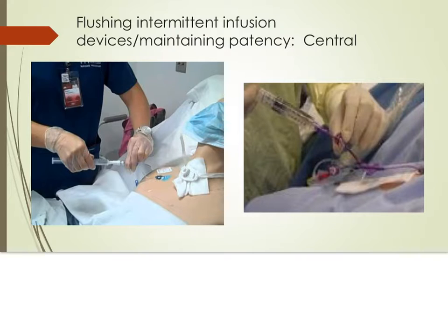Use a turbulent flushing pulse technique or start-stop technique. As you flush, carefully monitor the IV site to make sure there is no leaking, swelling, redness, sudden increase in heart rate, or patient complaints of sudden shortness of breath or chest pain. When the flush is complete, continue pressure on the plunger as you disconnect the syringe from the flush. Apply a new alcohol cap if required by your facility.